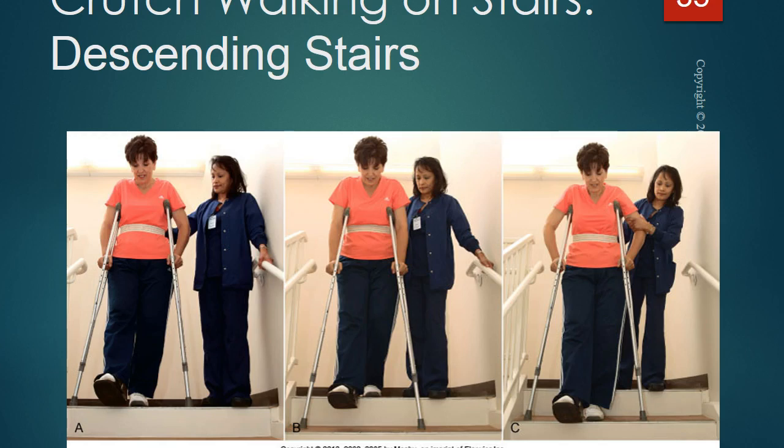Descending stairs with crutches. A three-phase sequence is used to descend stairs. The patient transfers body weight to the unaffected leg. The crutches are placed on the stairs, and the patient begins to transfer body weight to the crutches, moving the affected leg first. Finally, the unaffected leg is moved to the stairs with the crutches, and the patient repeats the sequence until reaching the bottom of the stairs. A good way to remember stair gait with assistive devices is up the stairs with the good extremity, down the stairs with the bad one.